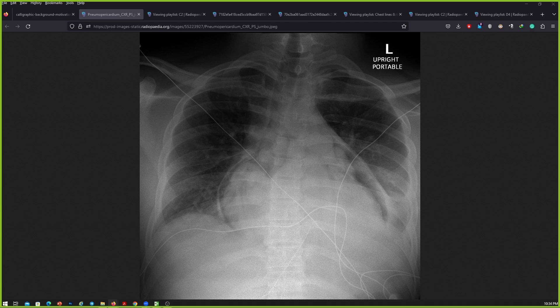Could you please point it out to us? — So this area here. And where is the pneumopericardium? — This is the lucency around the pericardium. It is extending near the apex and near the superior mediastinum, but it is not extending beyond that. So it is not a pneumomediastinum; this is pneumopericardium.